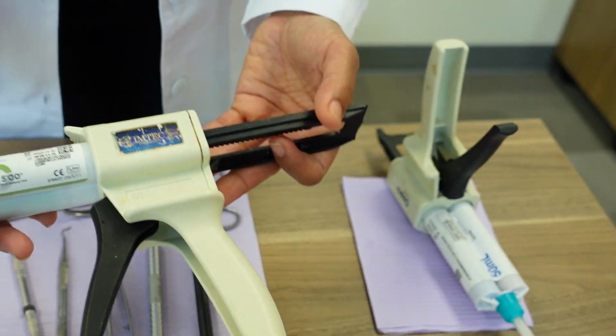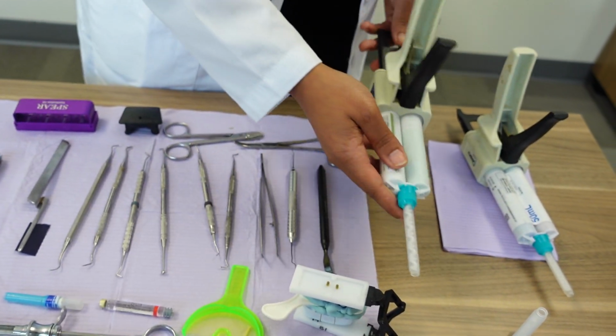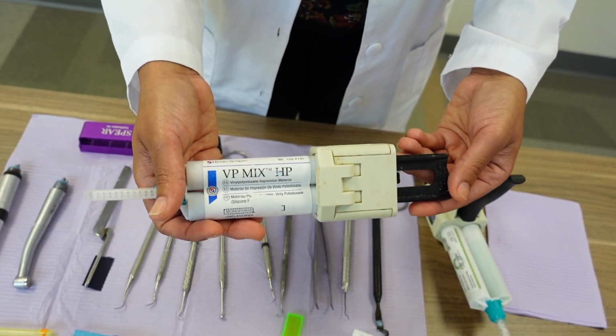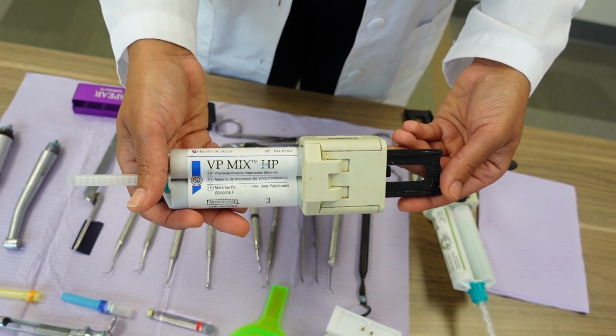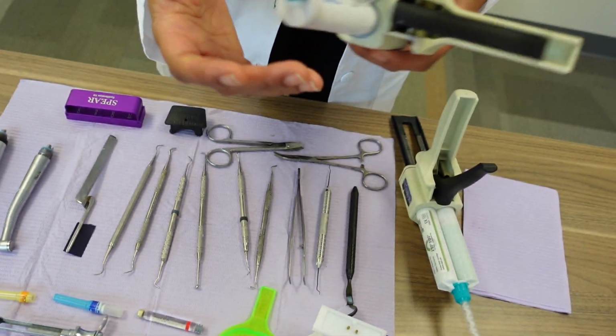Then we're going to move over to here, and we have the actual material, okay? This is like a heavy body material. This is used during the final impression, all right? This is like a light body type of material, and we use that also during the final impression. This is what we put around the gum tissue of the tooth before we actually take the impression.